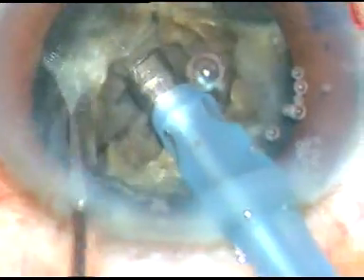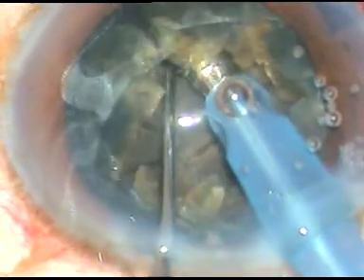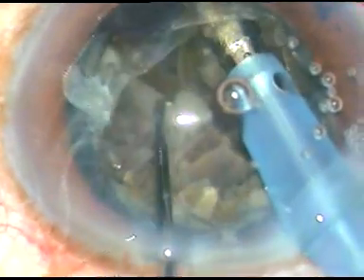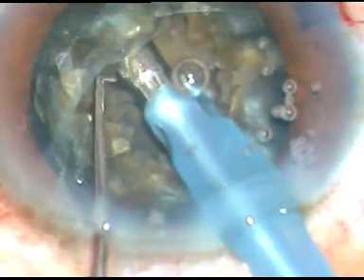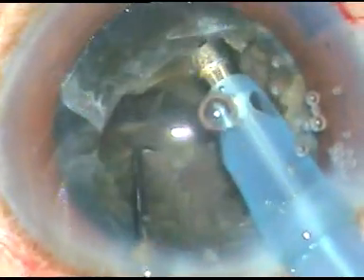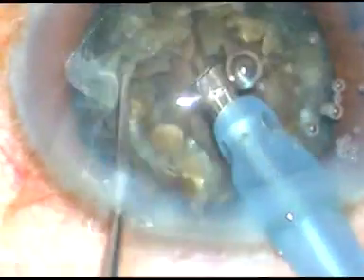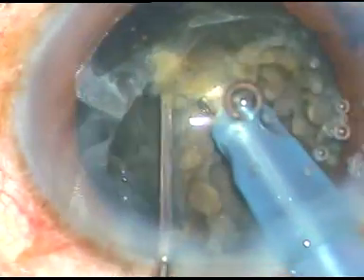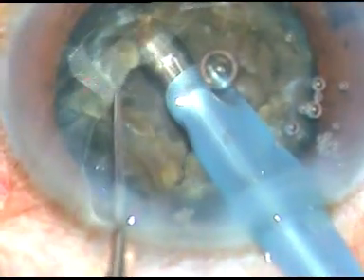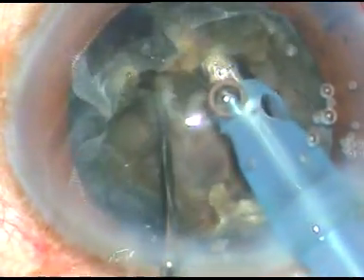I am chopping the nucleus into many small fragments, and here I have divided the nucleus into almost two halves. But the central plate — the posterior plate — is leathery and I am sure it is not totally separated.